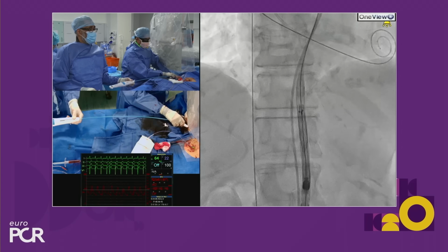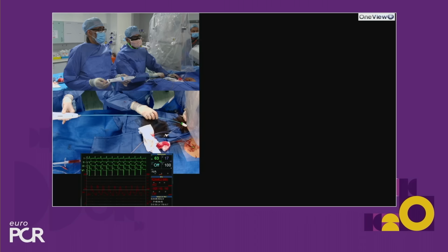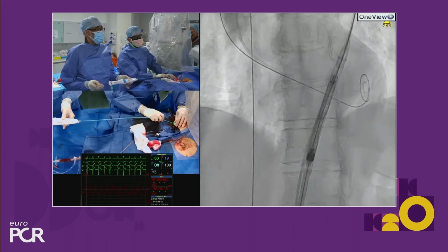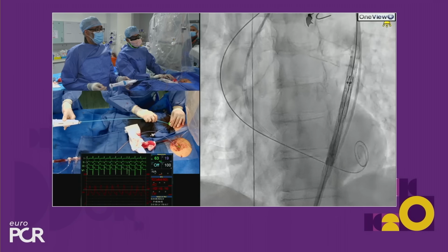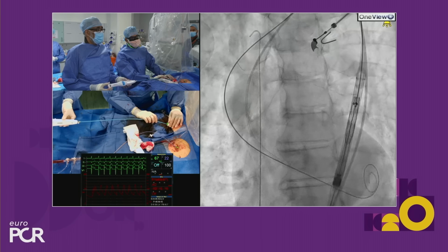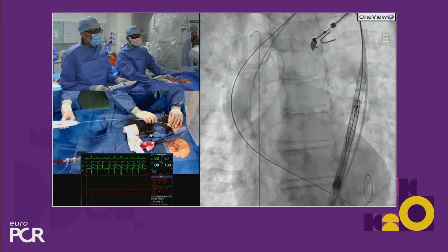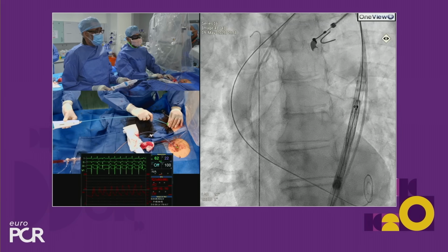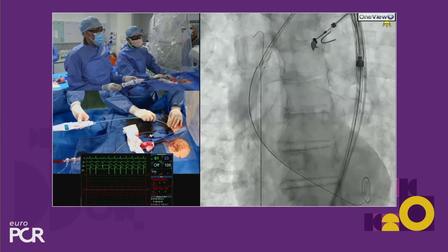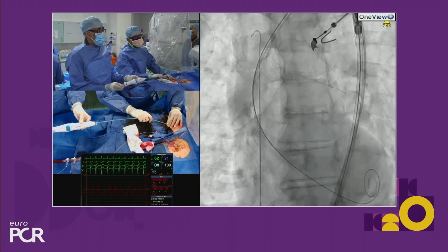Here we go. Okay, so let's pause there. That's good. Right, so let's screen in LAO and see what it looks like. Go up, follow up, follow up, follow up. Okay, so if I rotate, if we screen, you can see that the 3 markers rotate very easily, so that's fine. So let's hold in that view and we'll carry on. And I'm going to tug slightly because the arch is a bit tight. And we'll just let the heartbeat do the business.